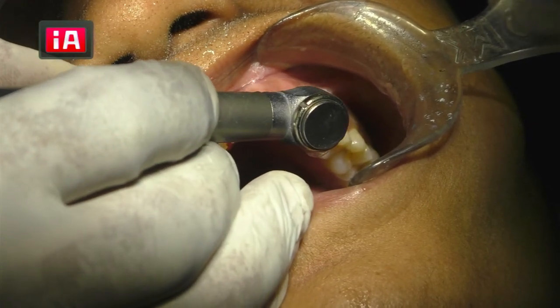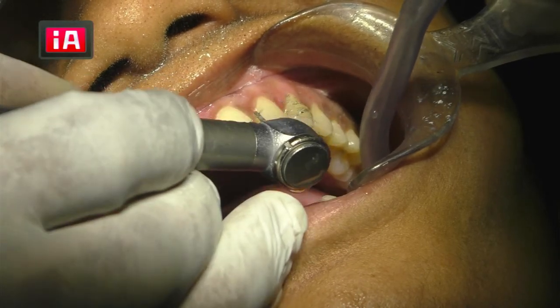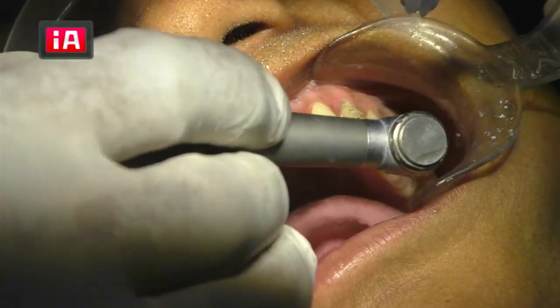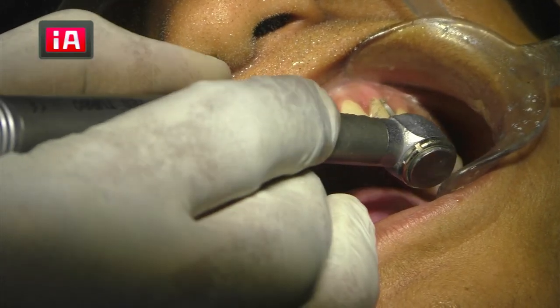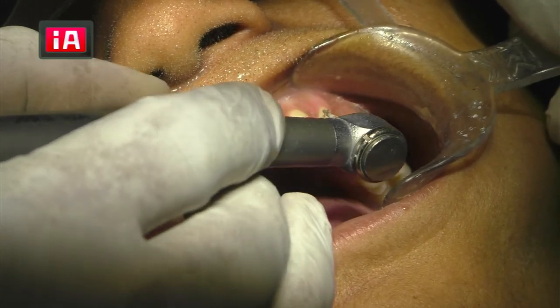Again, I'm telling you, you should not cut more. It should be very, very minimally invasive. Try cutting very less. Don't cut more. Now with the canine. Okay? So almost the labial finish preparation is done.